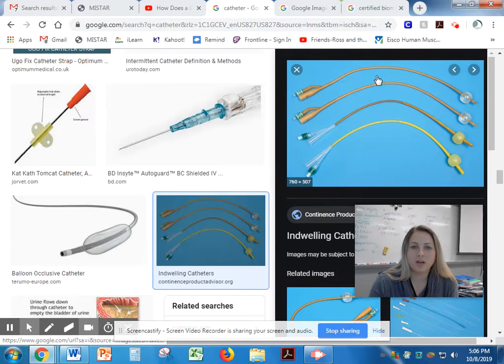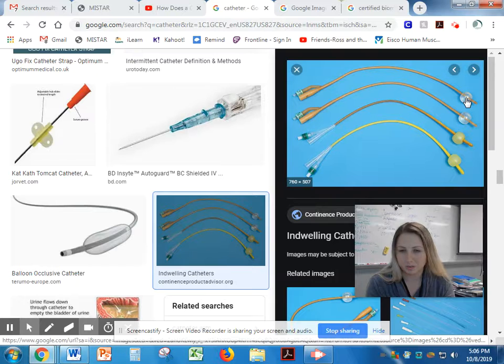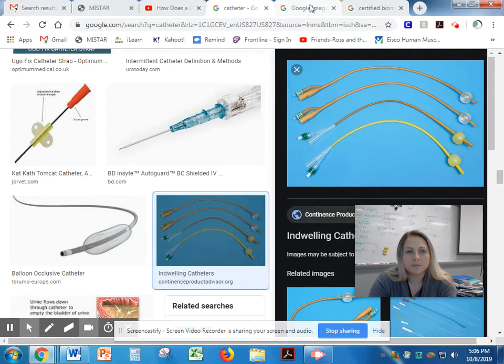So these right here are urinary catheters, right? And they go into the body, and then we use this end here to blow up this balloon, right? So this isn't actually blown up until after it's inserted into the urethra and gotten where it needs to go. We use urinary catheters for patients that are bed confined that can't get up to use the bathroom. We use urinary catheters for patients that are going in for surgical procedures, where they may need to use the bathroom, but they're not going to be able to get up to actually use one. So that's what we use urinary catheters for.